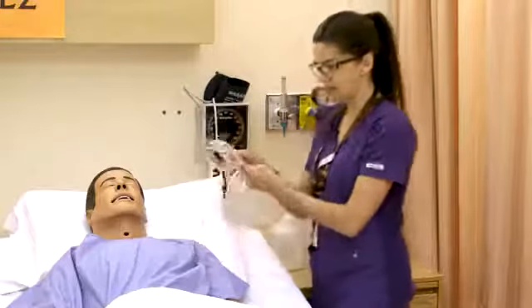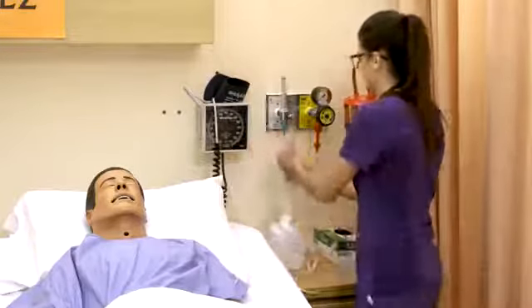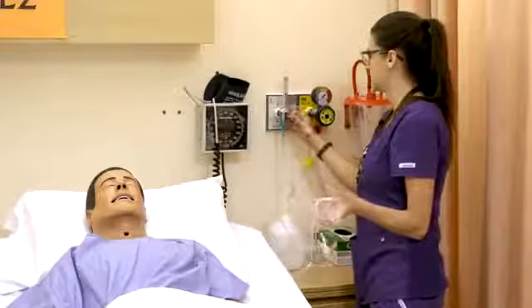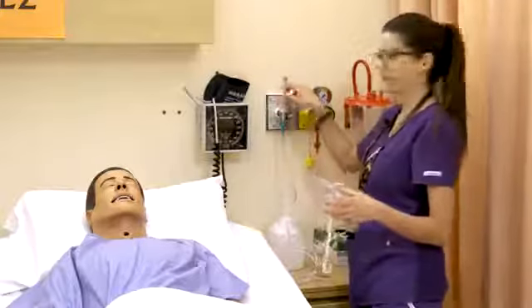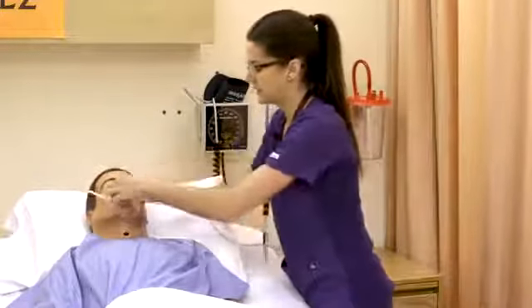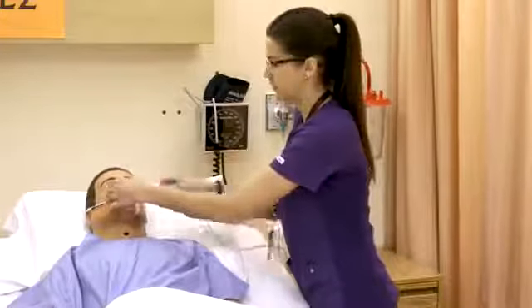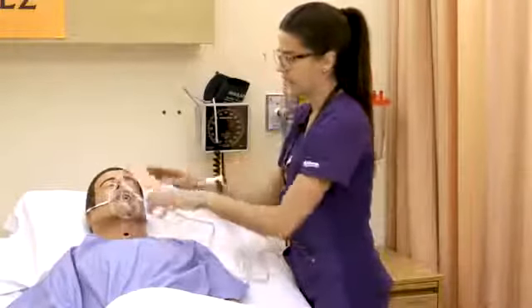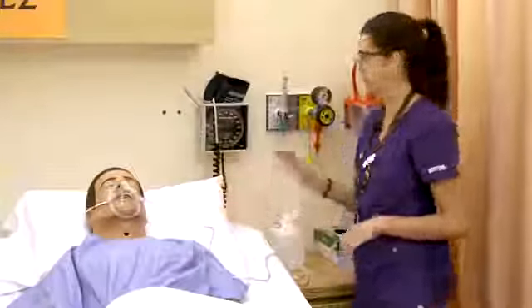So this one, same idea, we're just going to hook it up to our flow meter adapter and turn it on to our desired rate. So say we want 10 liters, again, that's where the ball is going to cross or get cut off by the 10 line, and we're going to apply it to our patient's face, just like this. So these ones are a little bit nicer. Also, this kind of moves, so if the oxygen's on this side, it easily adapts to that, or if it's on the other side, it easily adapts to that. So that's the basics of the Oxy mask.